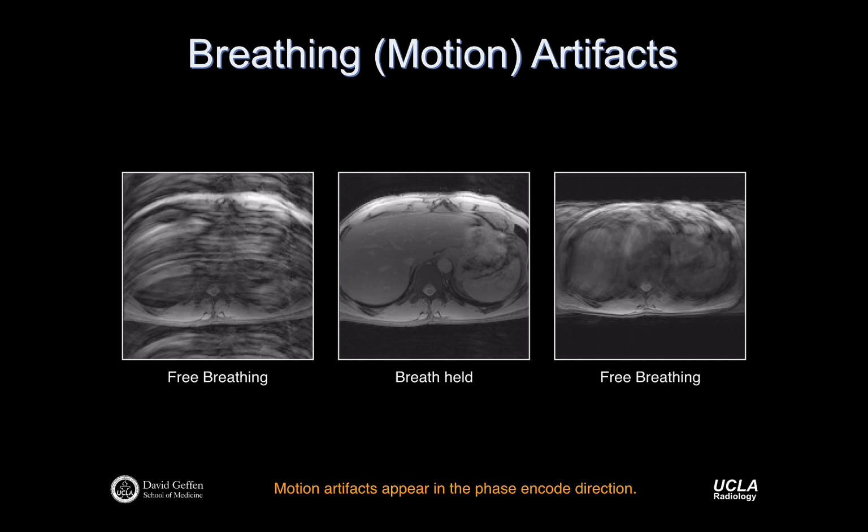It's perhaps a little bit better if we can change the phase and frequency encoding directions, right? So on the scanner, we can choose if we want to phase encode left-right, phase encode anterior-posterior, or something else. So what's the phase encode direction for this acquisition of red? Yeah, right-left, right? So the motion artifact, it might not be really apparent that it's in the left-right direction, but it's definitely not in the AP direction. There's really no artifact at the bottom and no artifact at the top. So you can choose that on the scanner, the direction of frequency encoding. And then it's probably obvious at this point, but what's the direction of phase encoding for this image?